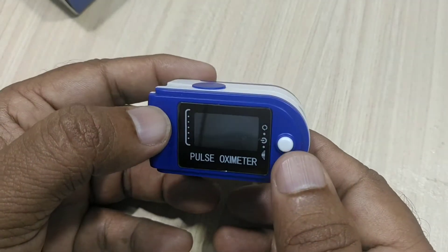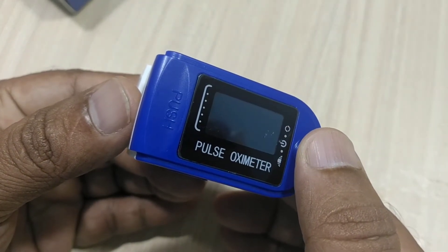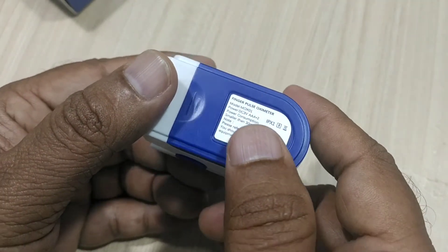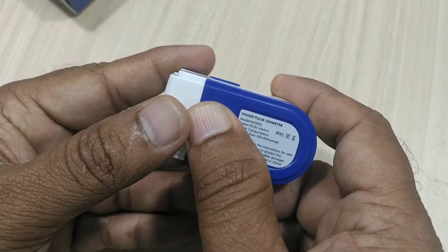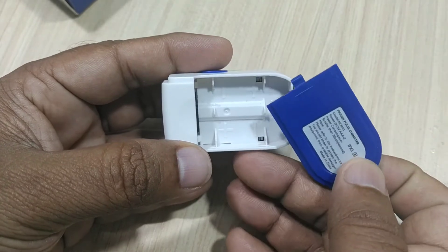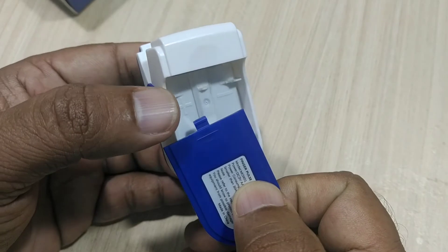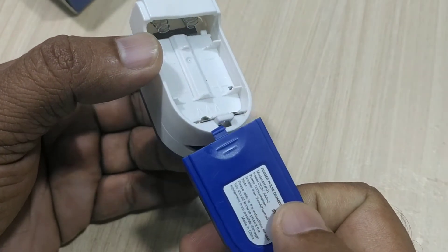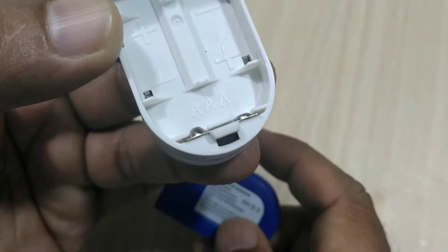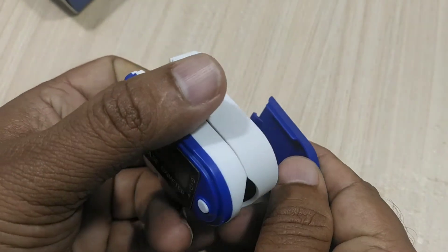Our pulse should always be in the range of 50 to 100. This pulse oximeter will work whenever we press the power button. To work this power button, we have to supply some power through batteries on the backside. To work this particular meter, you need to supply two AAA batteries.